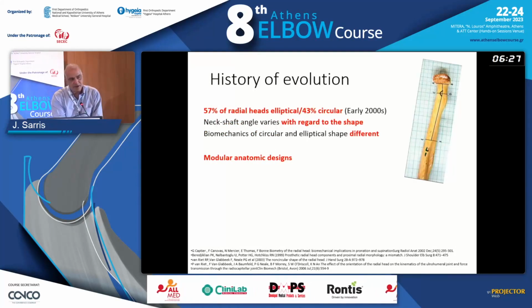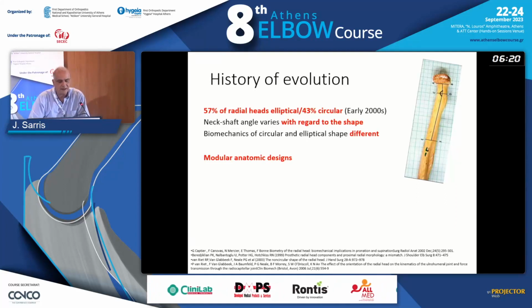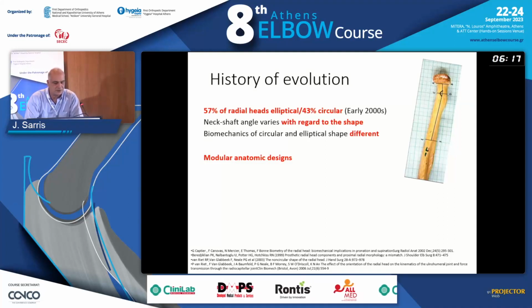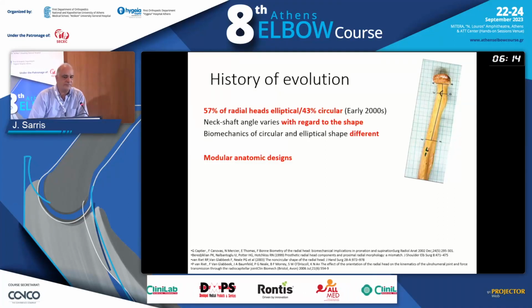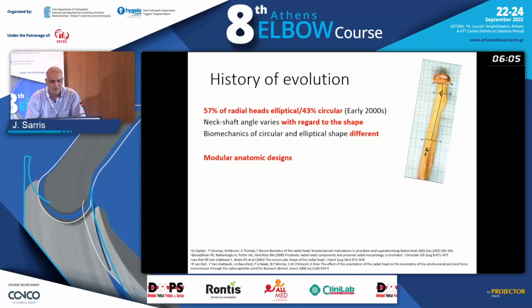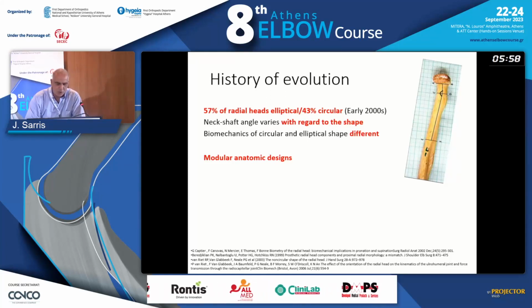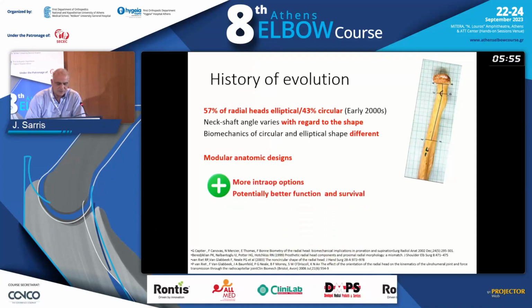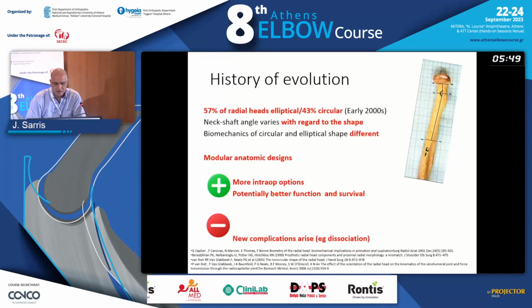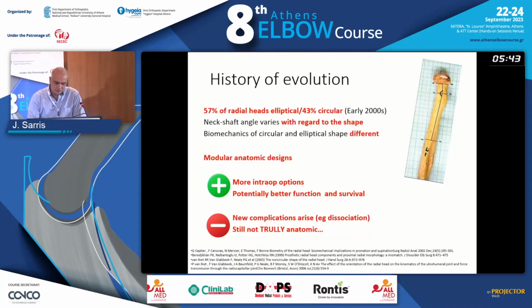So if we see the more modern biomechanics of the radial head, more than 50% of all the radial heads were elliptical, 43% were circular. So the neck shaft angle also differentiates according to the shape of the head, and the biomechanics also are different. More or less load is passing through the radial head depending on the shape. So we now have more modular anatomic designs, which give more intraoperative options, potentially better function and survival rates. But we have new complications that have arisen, and still they're not truly anatomic.